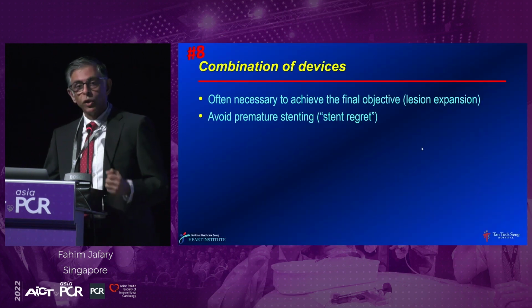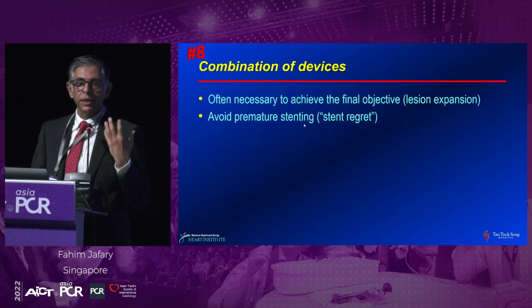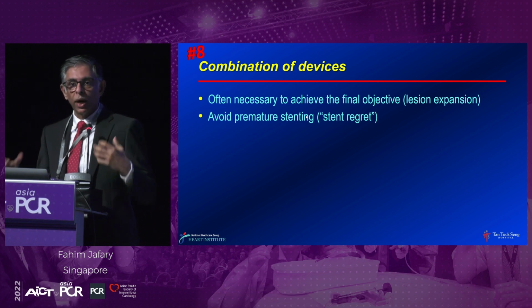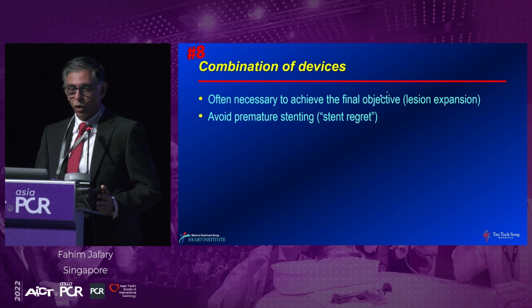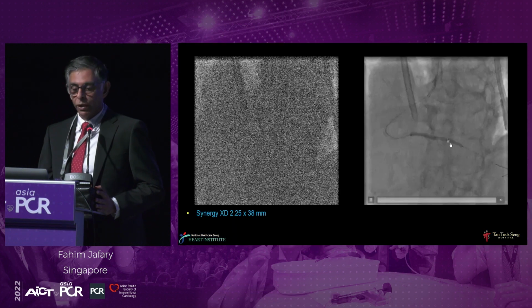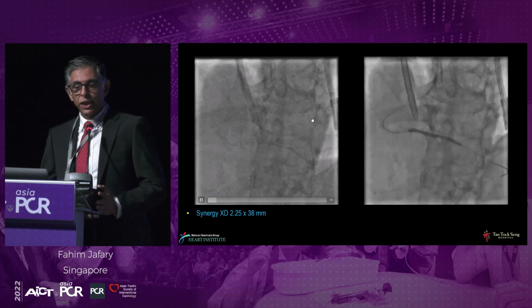This brings us to the next principle about IVL, which is that IVL is often something you have to use in combination with other things rather than on its own. You have to use other adjunct devices. Basically the idea is to expand the vessel and not have stent regret. And then the rest of it is just simple angioplasty.